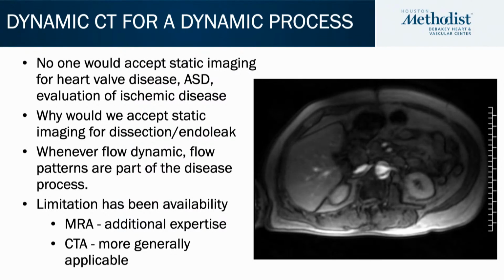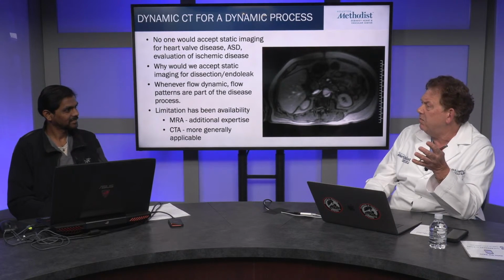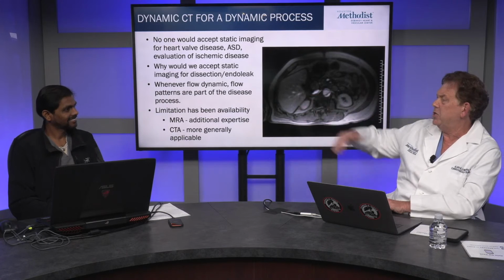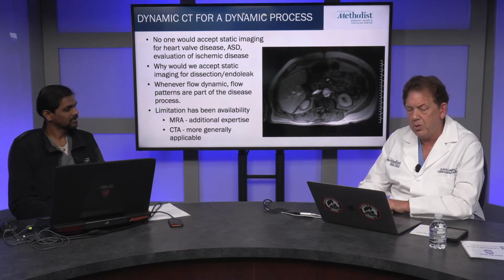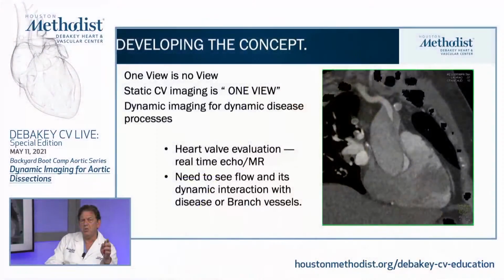No cardiologist or cardiac surgeon would think about treating a mitral valve with a single CT scan. It's all about the dynamic imaging that's going on. We're trying to develop this concept in static imaging. We say one view, and angiography is no view. We believe that one instant in time in a CT scan or MR is essentially functionally no view, and there's so much more information that you can get out of that.